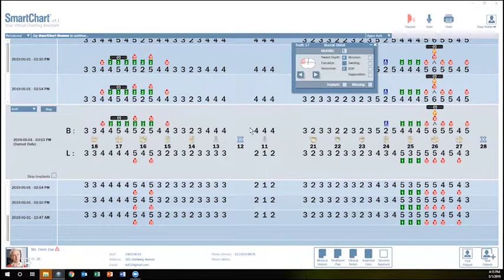Okay, so we've completed all the charting. A couple of mistakes were made. It didn't register properly, so it's pretty easy to go back and just remove the number. In fact, you don't even have to say remove pocket depth once it's in the space. You can actually just override that number by saying the correct number.